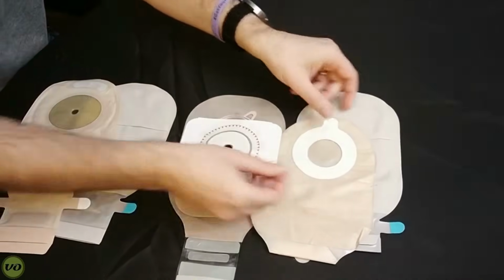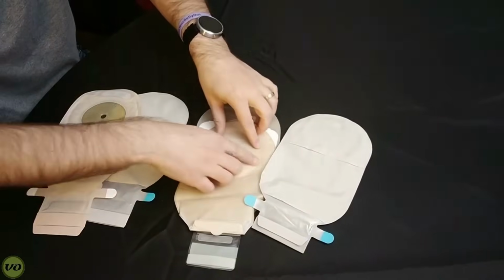So once you remove the liner, you basically stick these together. Now, the advantage of doing that is the fact that when you're putting your wafer on, you can make sure that it's around your stoma properly, make sure there aren't too many big gaps or anything that might need correcting. You can basically align your wafer properly.